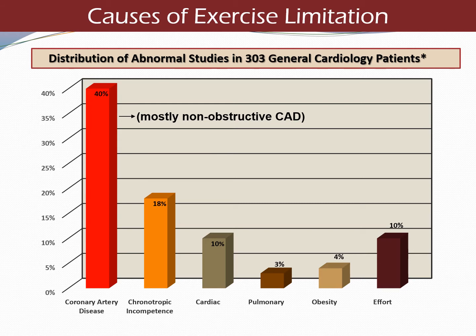What we see the most of is primary cardiac impairments that fall into one of these 3 categories. If their myocardial function is normal, or cardiac output is normal in early exercise but decompensates in late exercise, that's an inducible ischemic pattern that can be from micro plus or minus macrovascular disease. About half of those individuals show up here. The ones that have diastolic dysfunction with normal echoes, about 10% of those fall there, and about 18% are severely blunted heart rate responses, which most of the time is medical patients in need of medication adjustment.